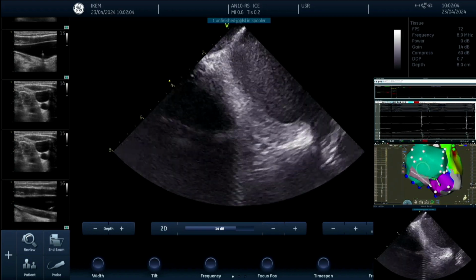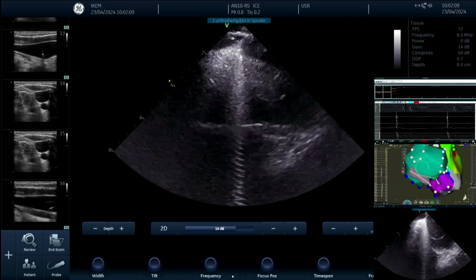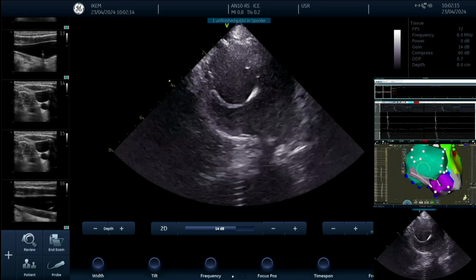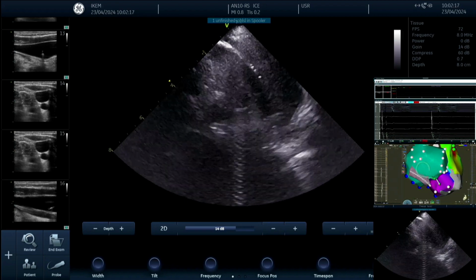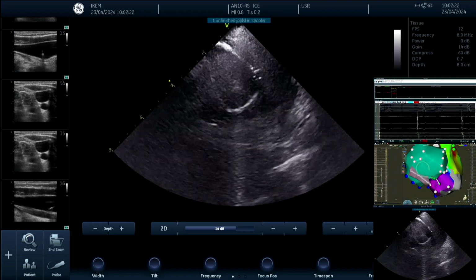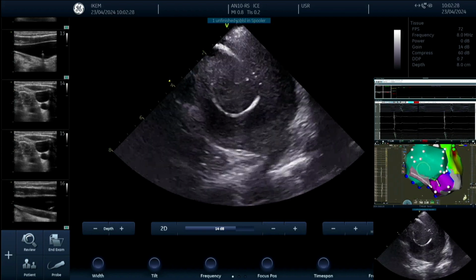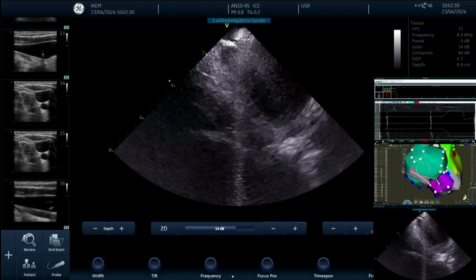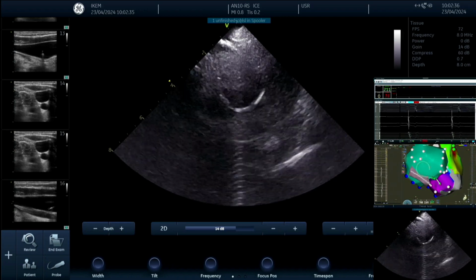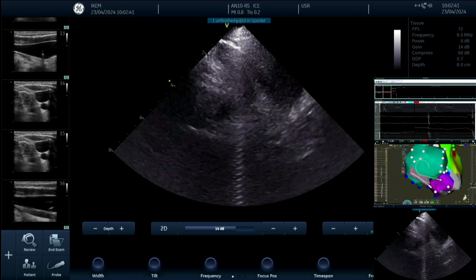Again, emphasizing the role of intracardiac echo for complex EP procedures. ICE is useful to tag these important points. It's not very close to the right inferior pulmonary vein. Okay, so we can burn. How many watts do you want? 35 and up to 500. Okay, 35 watts ablation here, please. Contact is good. Go. Bubble. What happened? Okay, we have some technical problem with the ablator. Stop.